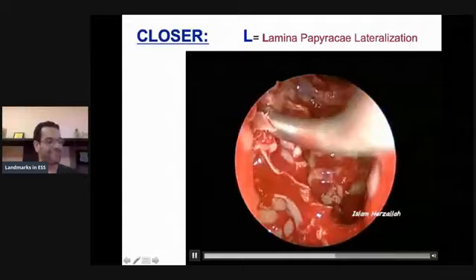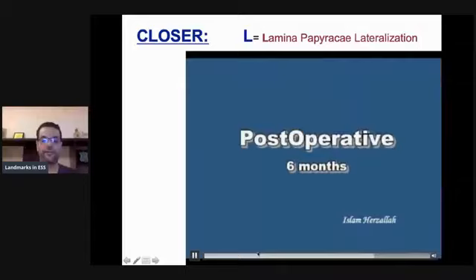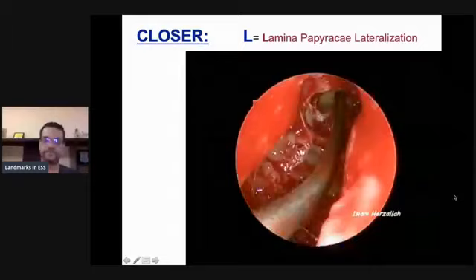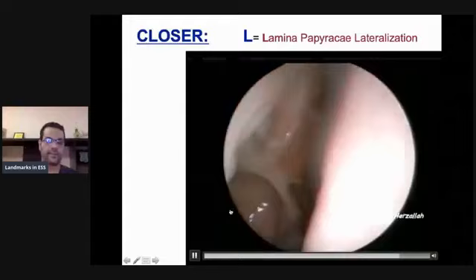So, okay. As you see, you now have cells on the lamina papyracea that I've been dissecting away from the sagittal plane of, see, this is the sagittal plane, this is the middle meatal antrostomy, and you see the cells are far lateral to this plane. And then now I'm getting into the frontal sinus, clearing the skull base as well, postoperatively, as you will see. See, this is the frontal skull base, sphenoid sinus, posterior ethmoid air cell right here that I'm going to talk about in 10 minutes. And then you have the middle meatal antrostomy, the lamina is clear as well.